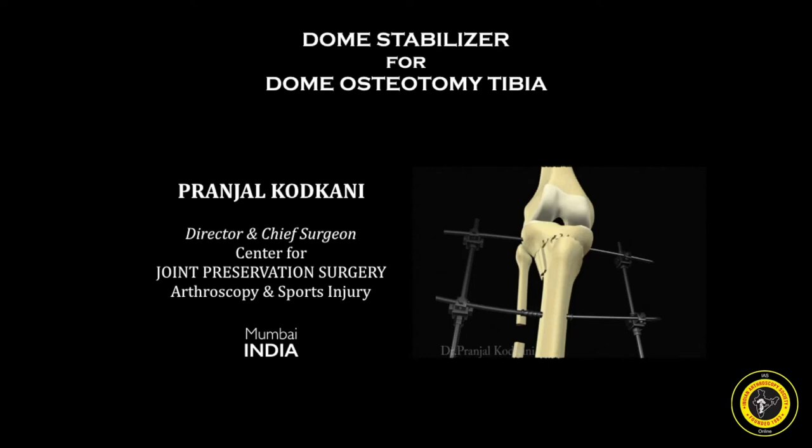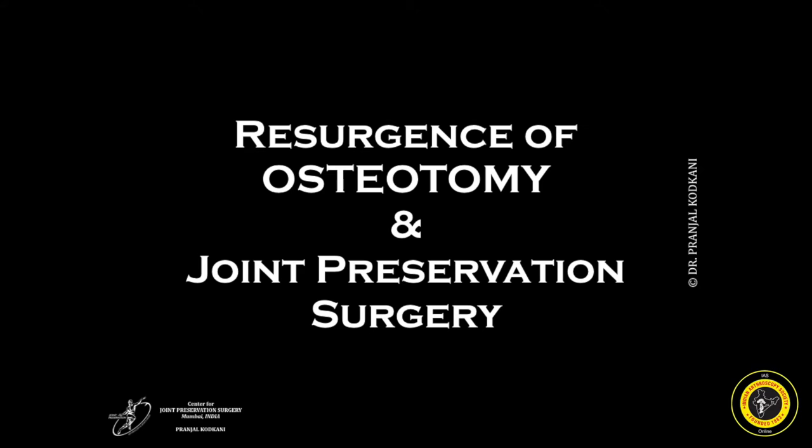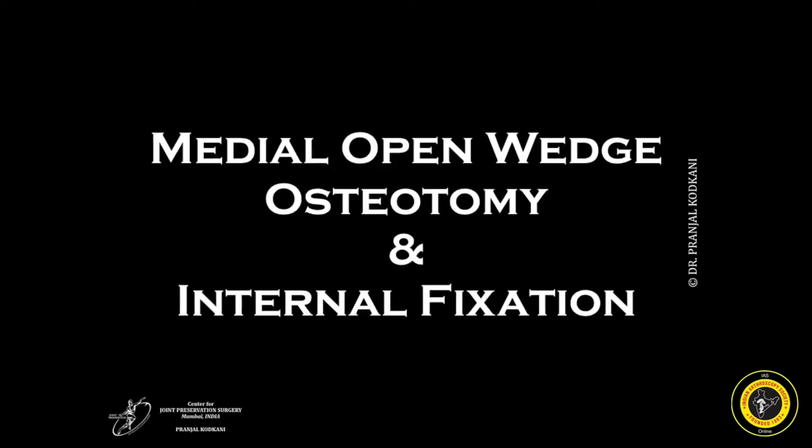Presenting to you the Dome Stabilizer for Dome Osteotomy of Tibia. In the recent past we've seen a resurgence of osteotomies and joint preservation surgeries, especially for the knee. The medial opening wedge osteotomy with internal fixation is the most popular option.